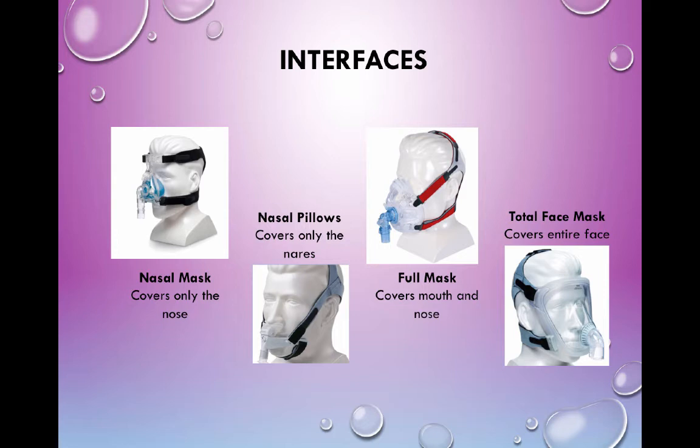So in a patient like that, we'll typically move them to a full mask, which is that top right one with the red band. That's a full mask. They're very uncomfortable. You can't talk because everything's covered. If you work your mouth, the thing rides around. They're just not comfortable at all. And that's typically what we will try to use on a patient in respiratory failure. So you're short of breath, you don't have a lot of patience as it is, and we're going to strap this thing on you. It doesn't work very well.